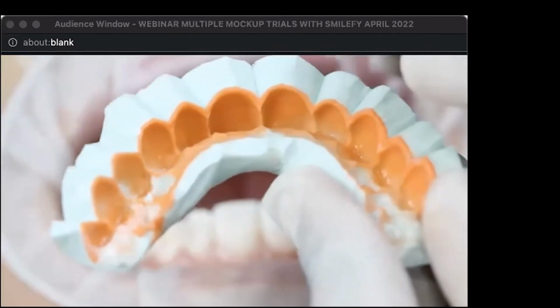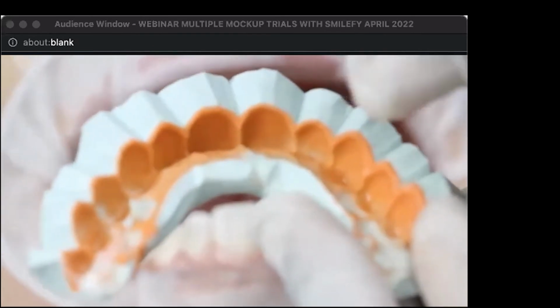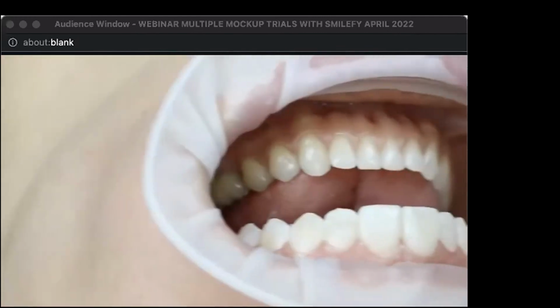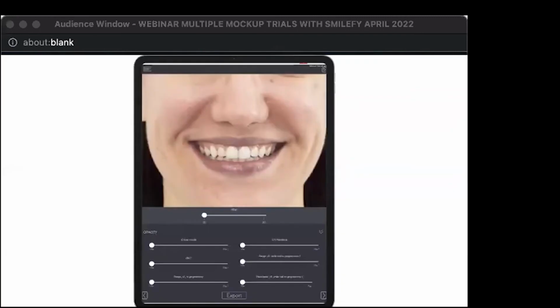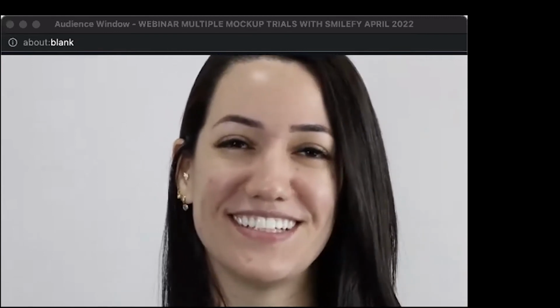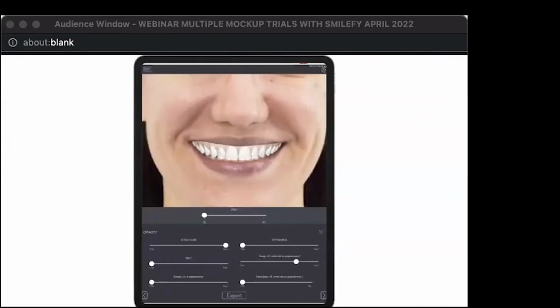So that's a close-up of the wax-up. Notice that I cut the model as close as possible to the design, so that all the excess could be removed in a much simpler way. After small adjustments, the patient was able to occlude without any problems. And then I took some pictures and videos of that patient. So this one is the one with the gingivectomy. That's option one.